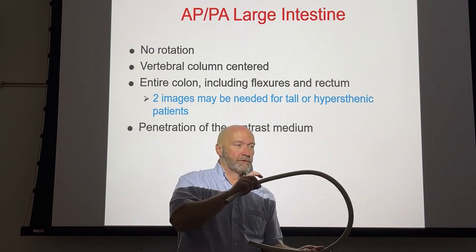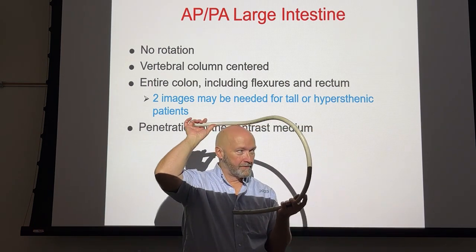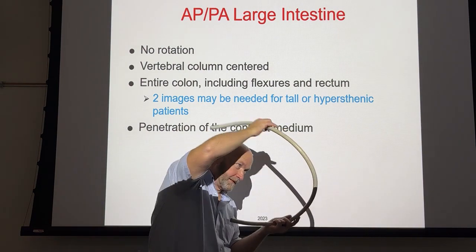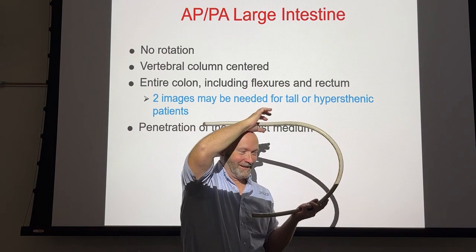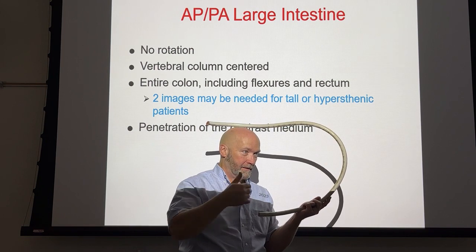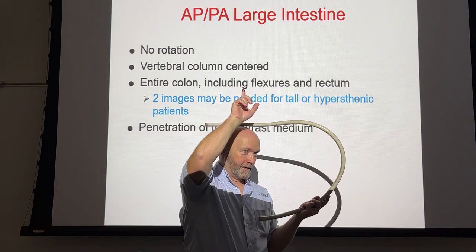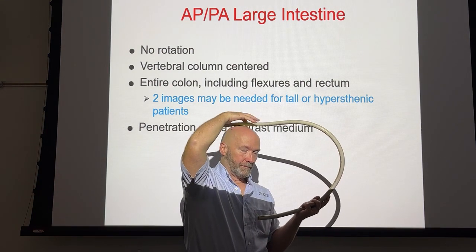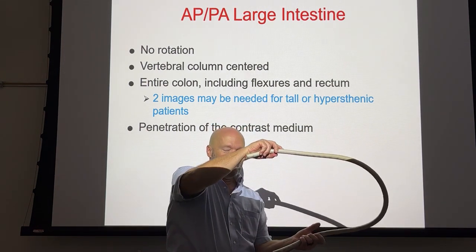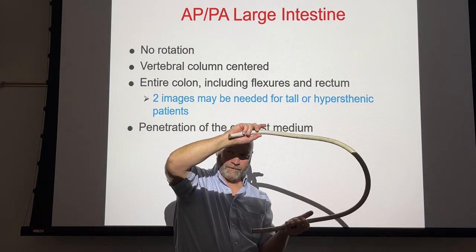Down, right. So the air is going to be up, right? So what we're going to see then is, I can do this. You're going to see the patient's on the left-hand side, so this is going to be descending colon, right? So you're going to see the medial side of the descending colon, okay? Lateral side of the ascending colon. The patient on the left-hand side. You got me? Most of the air is going to be on the lateral side of the ascending. Lateral side of the ascending colon, medial side of the descending colon.